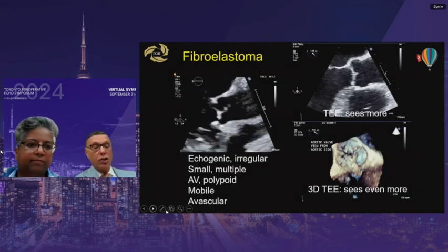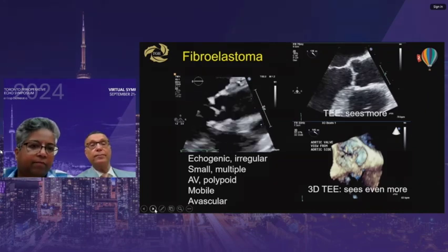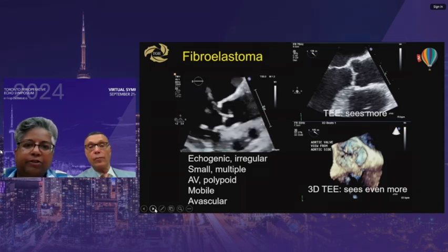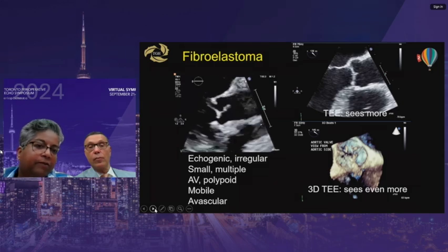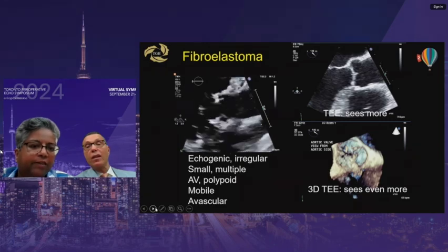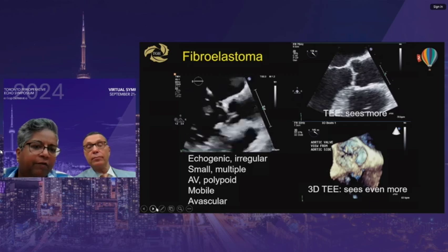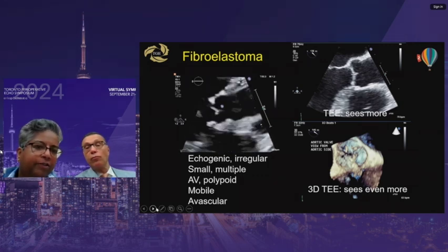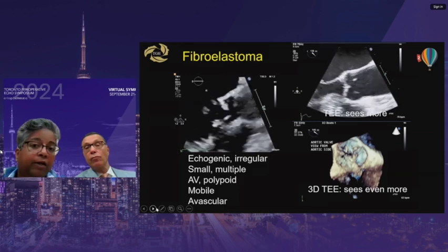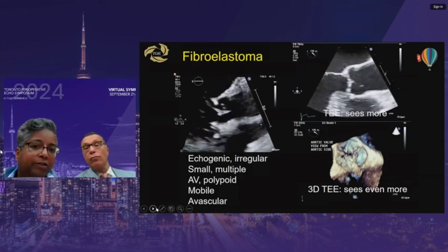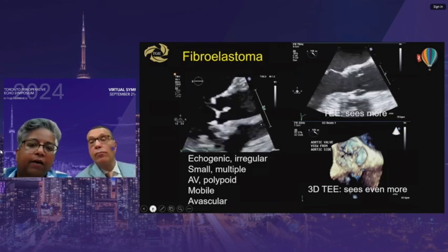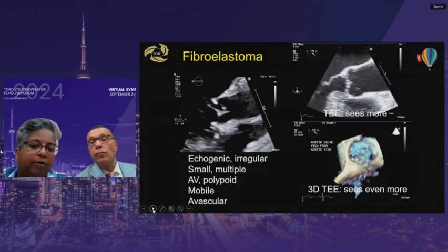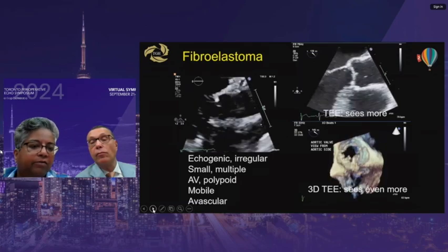Myxomas and fibroelastomas do occur in children. Fibroelastomas usually occur on the aortic valve — where Lambl's excrescences are also found — along with vegetations or unusually thrombus. This patient had a mass growing on the aortic valve seen on serial echos and was referred to surgery. On transthoracic echo it's echogenic, irregular, small, and multiple. On transesophageal, similar detail is obtained. On 3D, multiple lesions are visible — whether all are fibroelastomas or some are Lambl's excrescences is difficult to differentiate.